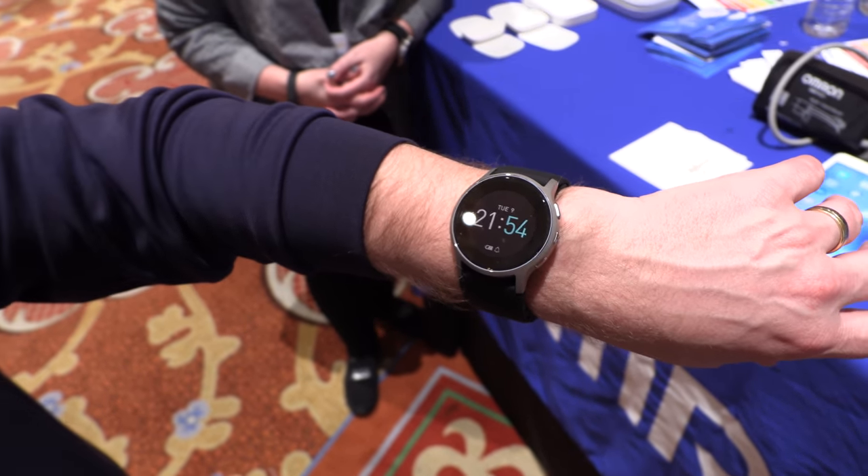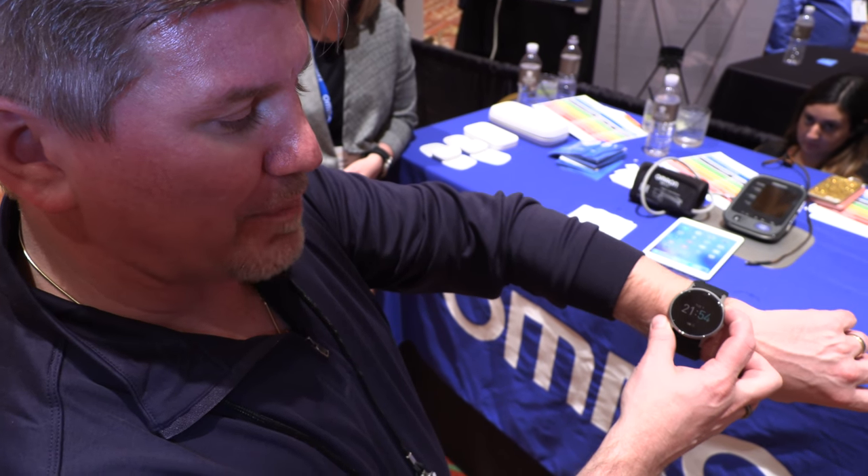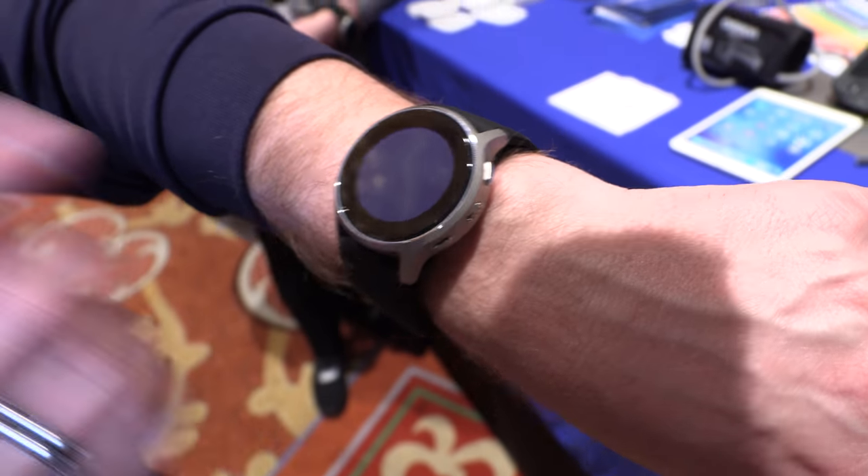That's actually the time. It's the time — because if you're going to make it look like a watch, it should tell the time. But if I want to take my blood pressure, what I would do is press the start-stop button. It's going to squeeze your wrist? It is. I'll show you in a second.